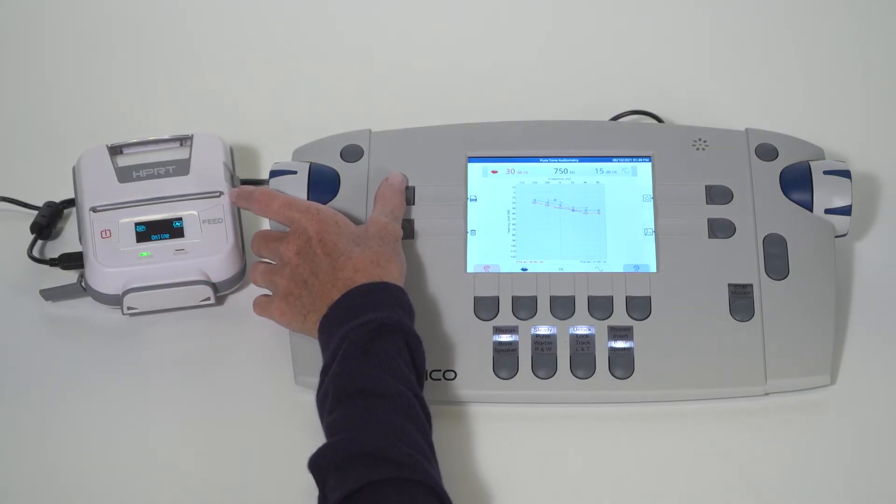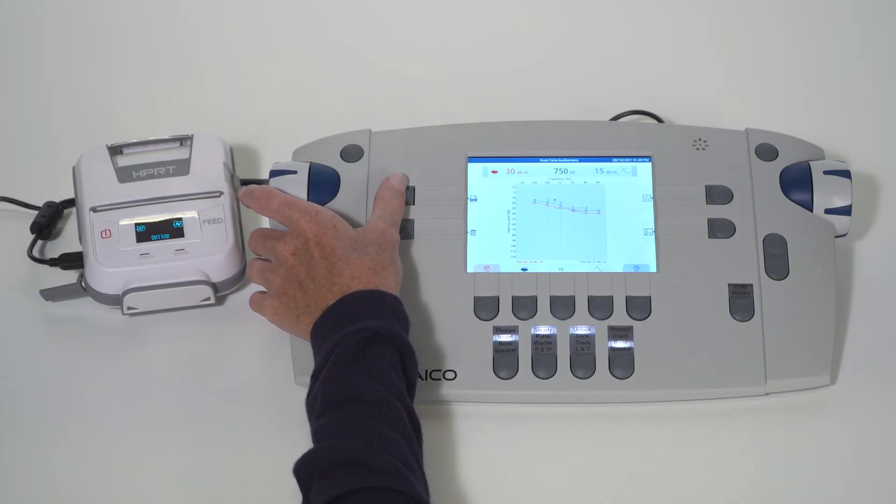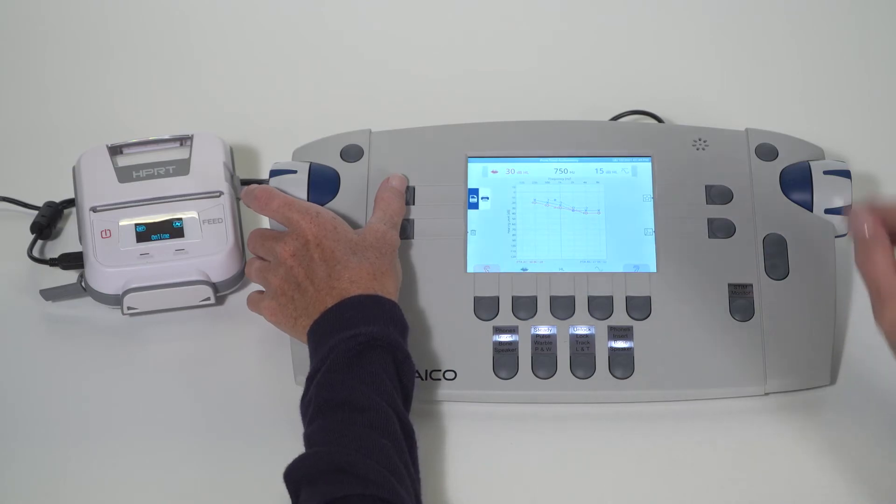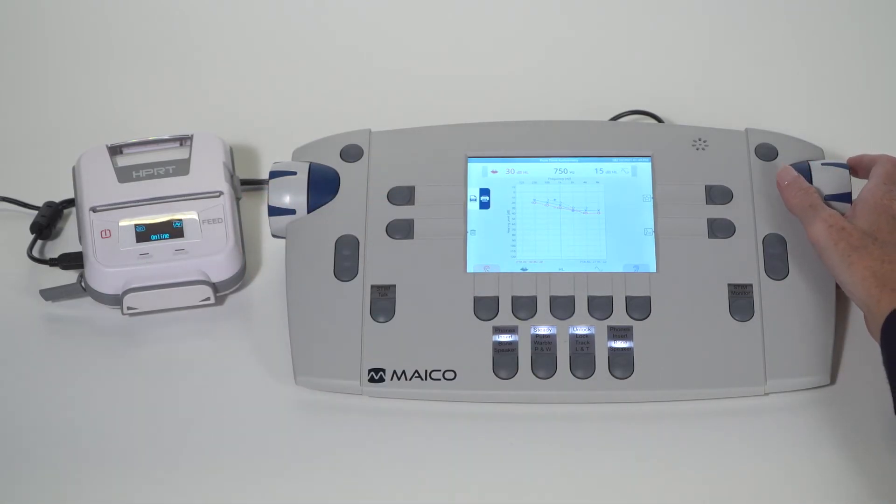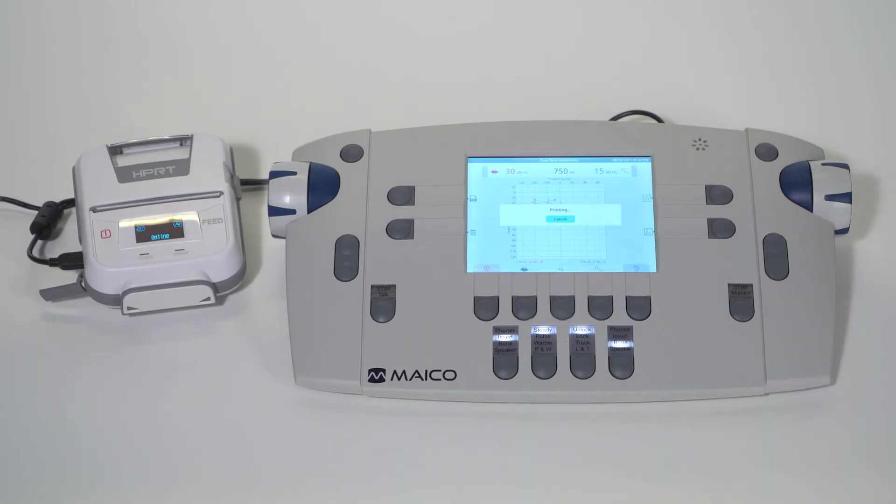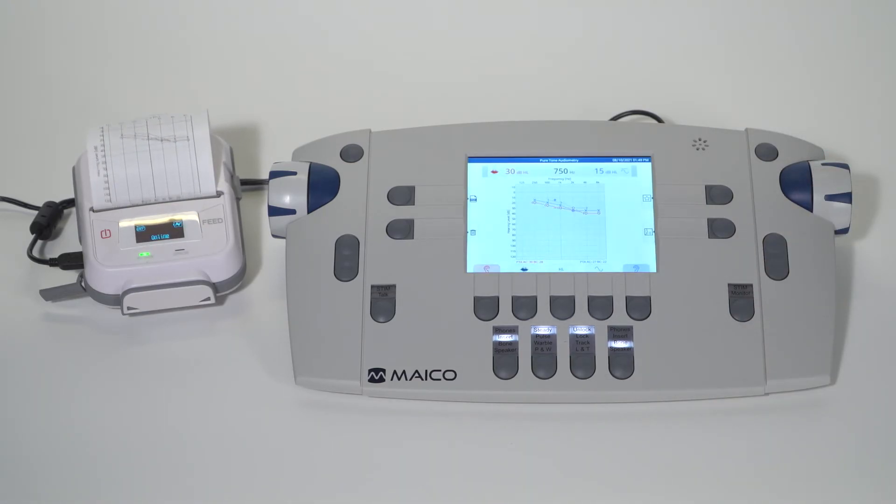Pressing print will print the results to a printer that is directly connected to the audiometer. The printer available is a 3-inch thermal printer that is an optional accessory available to order. Please consult your distributor for purchase of this accessory.